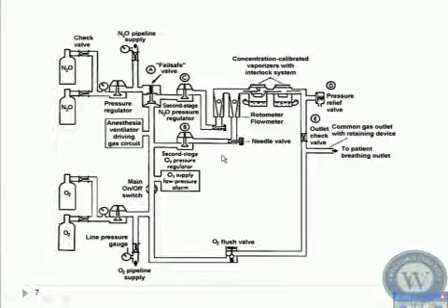So anytime that you have a pressure reducing valve present, the goal is that it just prevents a lot of turbulent flow from happening. Because if you allowed that force to go throughout the machine, you're going to get turbulent flow at all levels that there's turns, at all levels that it goes. You definitely don't want that sort of pressure running through your vaporizer, and you, of course, don't want that type of pressure getting to your patient.